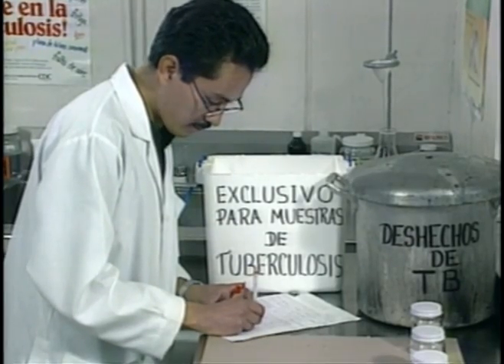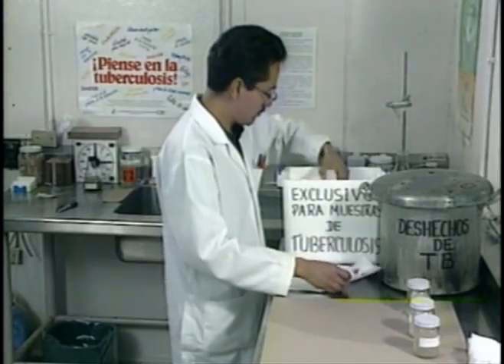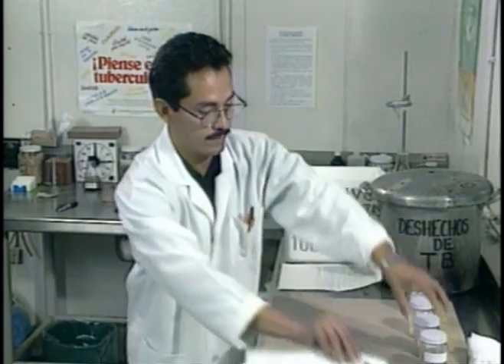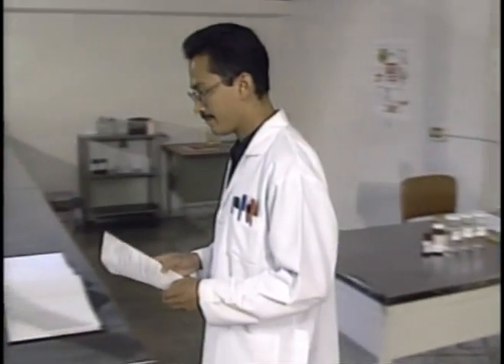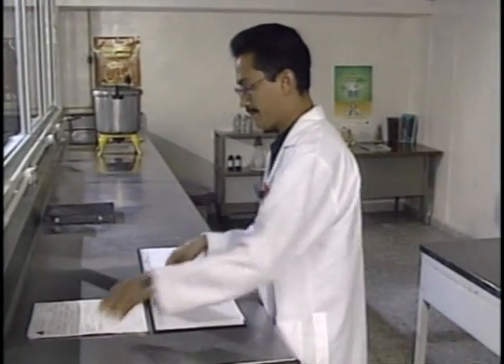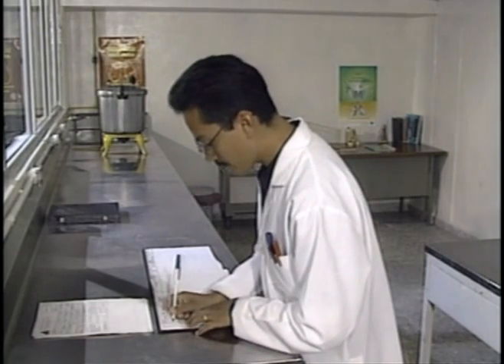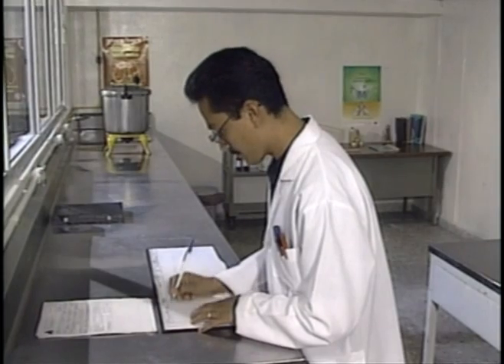All specimens must correspond with the accompanying list containing data of the TB suspect. Once verified, record all information in the laboratory register. The WHO or IUA-TLD laboratory register is strongly recommended as a guideline. The format of the register should never be altered.